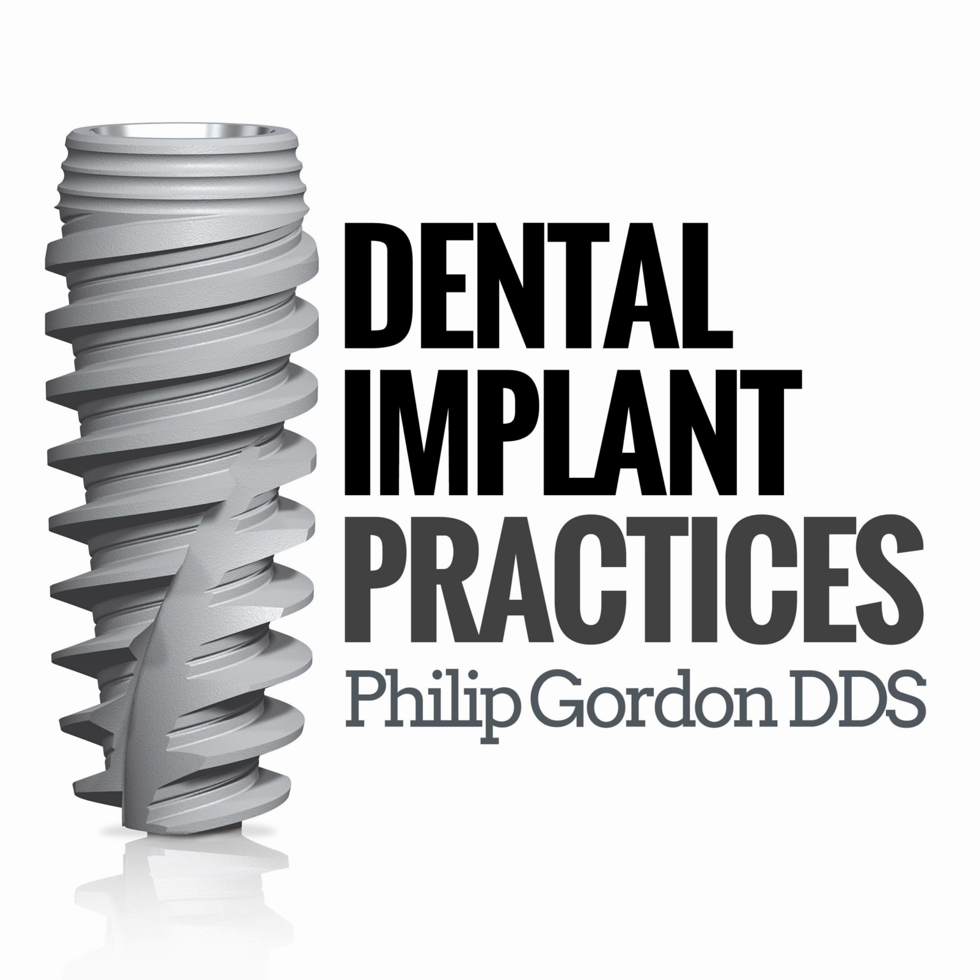What you want to do when looking at the surgical considerations is look at your instrument setups. Obviously, certain implants are made for certain final drills. You can place a Nobel Active implant with a Hahn kit, or you can place a Hahn implant with an Active kit. The first osteotomies are just to cut the general size and shape of the bone, but you want to look at the final drill dimension and ask, is that final drill dimension specific for the final implant? And if the implant is the same size, then you can proceed on.